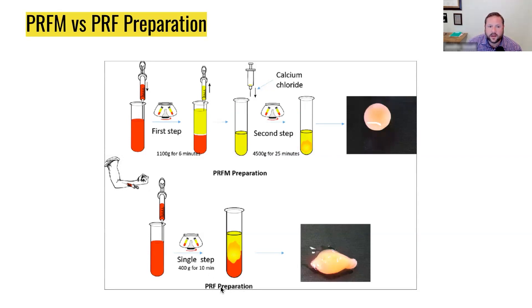For PRF — that kind of yellow clot-looking thing — you basically just take the blood, put it right into a blank test tube with no anticoagulant, and let it spin. Get it spinning as fast as you can, because if you let it sit too long, it'll clot and won't work. You let it spin while it clots, and you'll get this kind of yellow-looking, mucus-looking thing. This is the membrane you can cut up. You can mix it and use it for a lot of cool things — cut it up and put it into different products, mix with dermal fillers, or put into joints. If someone has tissue atrophy from a steroid injection, you can cut these up and inject them through a large-gauge syringe into that area. You can massage it, and it will just sit there and release growth factors over time.